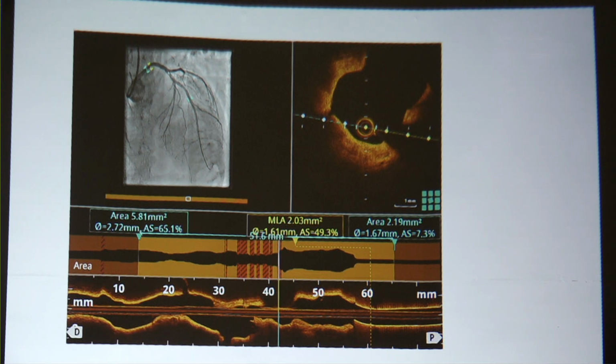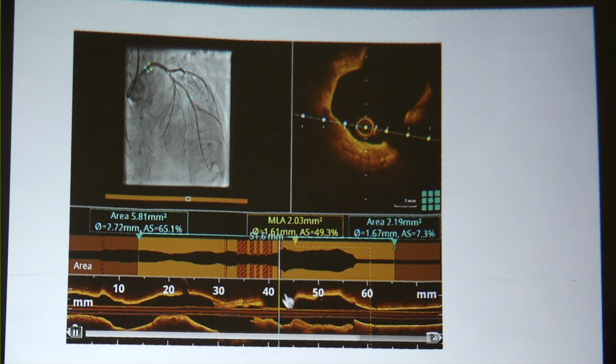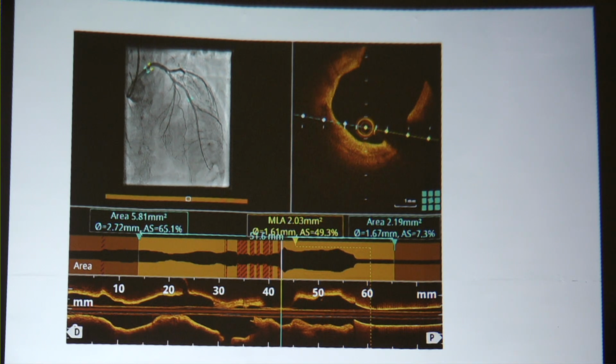And one thing you should remember is, many people confuse between a recanalized thrombus and a SCAD. In a recanalized thrombus, it is limited to the intima. It doesn't go to the media. But in spontaneous coronary artery dissection, there is a definite involvement of the media. That is, it goes behind the intima and that is involved there.